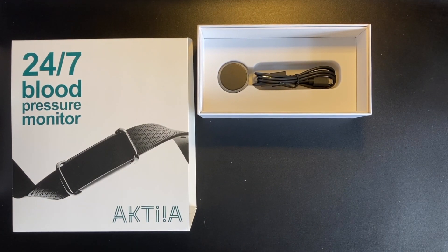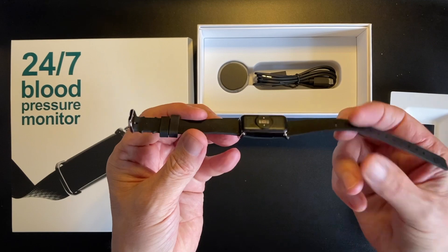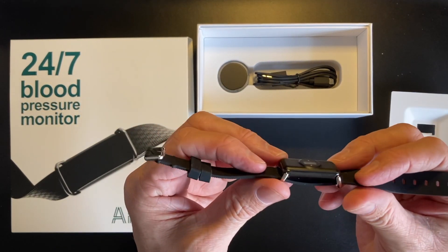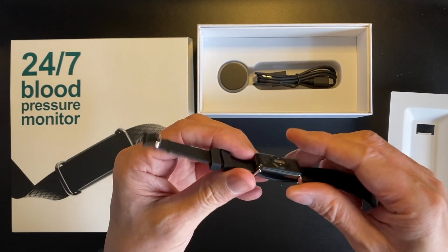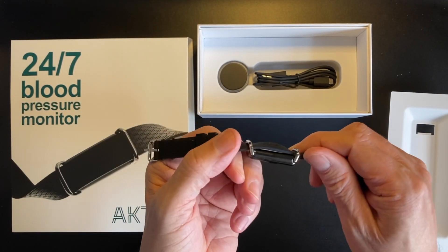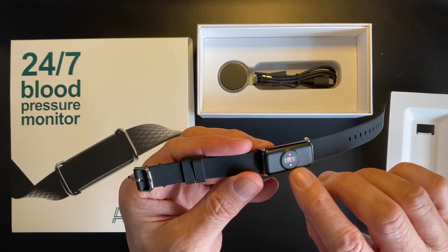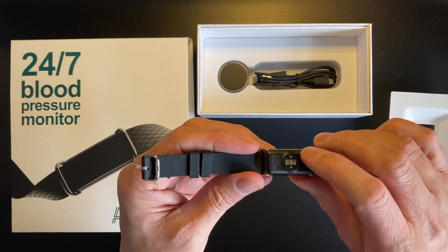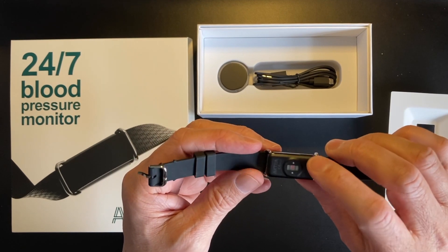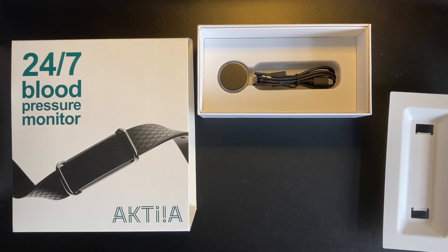Looking at the wearable itself out of its packaging, you can see it has a nice silicone strap, is really lightweight, and the device itself is very minimal. It has no actual lights on it and doesn't tell the time — it's a completely transparent device. The only thing it has is the PPG sensor on the back, which is the primary sensor for detecting blood pressure.